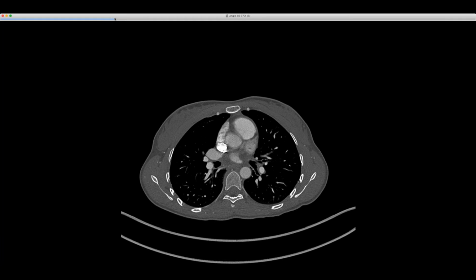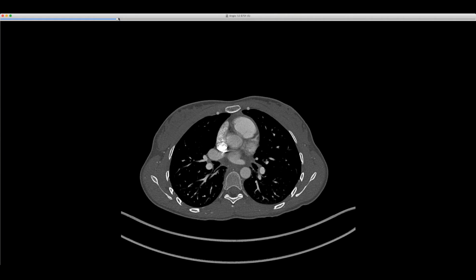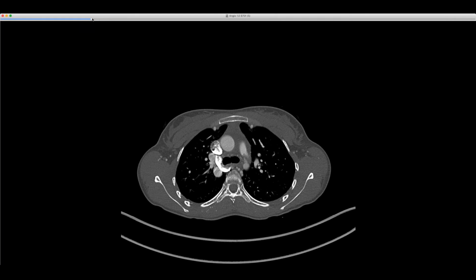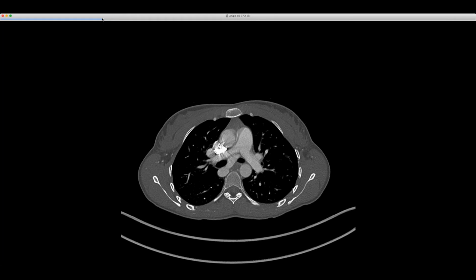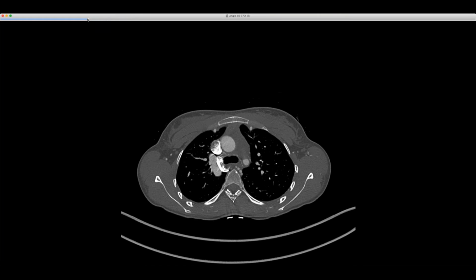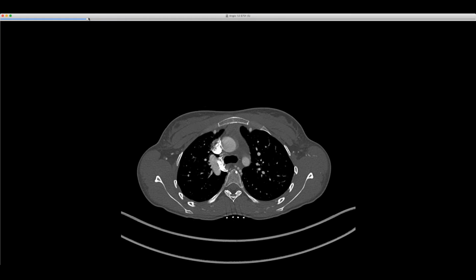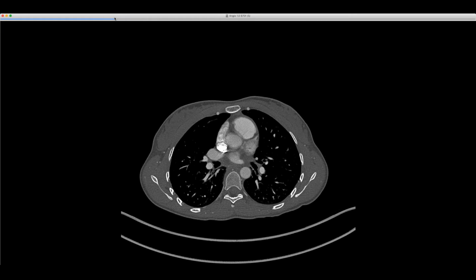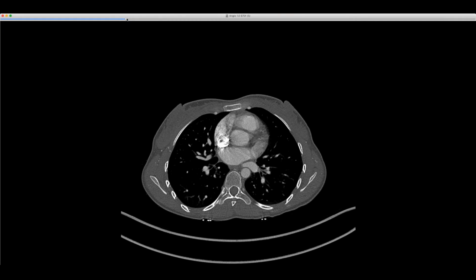So this is a really interesting meandering pulmonary vein that's meandering from one side to the next, just a dramatic meandering pulmonary vein. But I wondered, has anyone else ever seen this particular variant of a left to right or right to left crossing midline meandering vein? No, I don't think I've ever seen that.